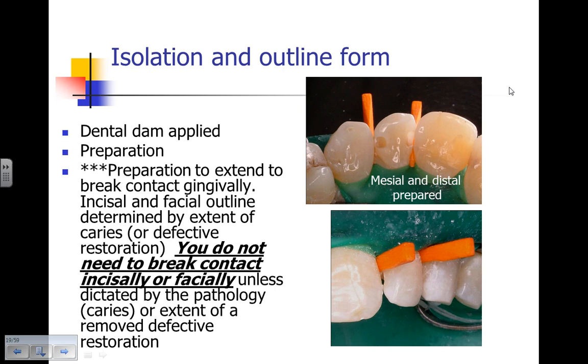The preparation will extend to break contact gingivally, and that's determined by the extent of the caries. It may or may not break contact facially. In this case, the mesiofacial did break contact. It may not break contact incisally. The extent of the caries and the preparation will be determined by the caries or the removal of a defective restoration.